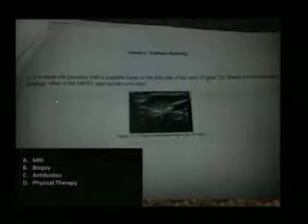This is an oblique sonographic image of the left side of the neck. What does this look like to you, John? Left side of the neck. Think about your neck. Touch your neck. Yeah, branchial cleft cyst. Okay. Or is it not? It's not a cyst. This elongates out. It looks like a spindle shape.